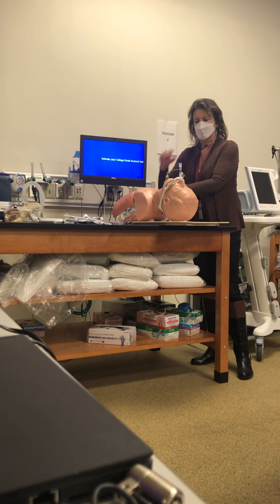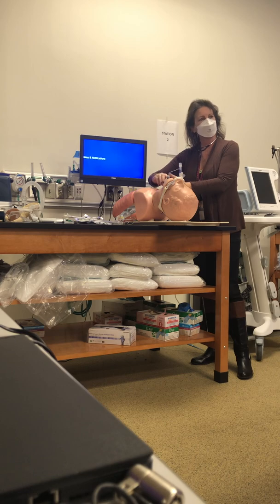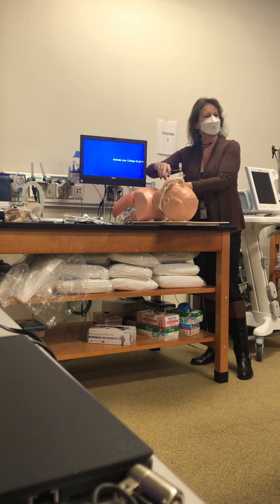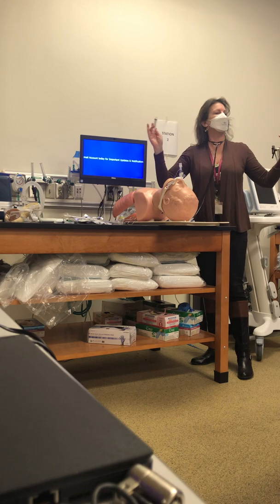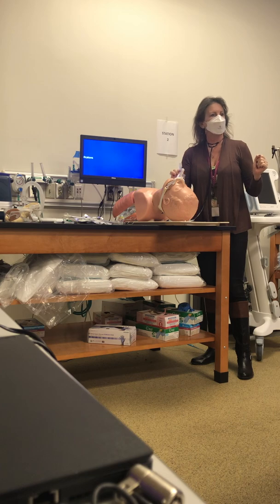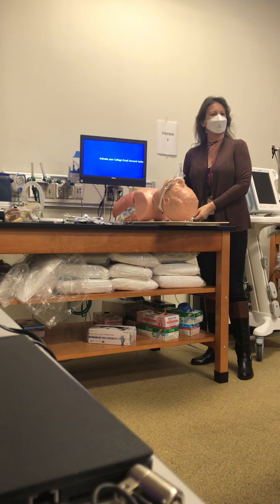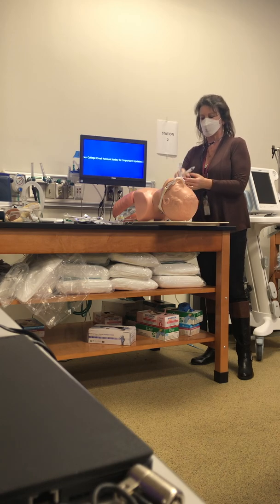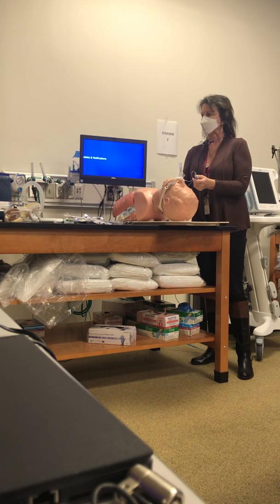So I hear a leak, and I say, okay, I hear the leak. I'm listening with my stethoscope right over here. So I hear a leak, I hear gurgling, and I put just enough air back in to seal that leak. The leak's gone. And I say, okay, I just did a minimal occlusion volume check, okay? I put just enough air in there to seal that cuff so there's no leak. The minimal leak technique is you would create a leak. You would create a leak.